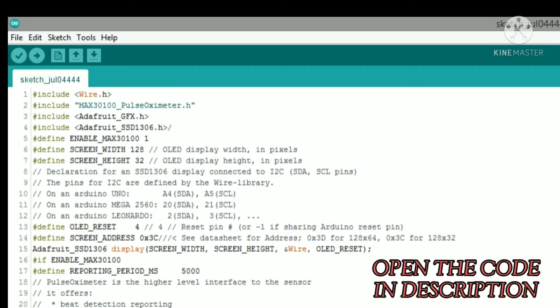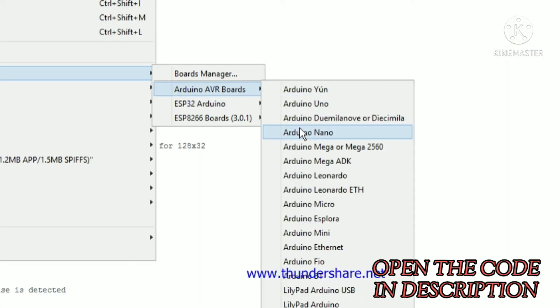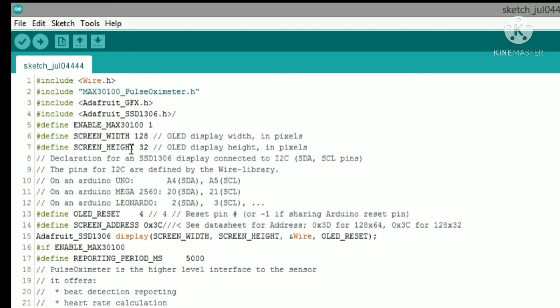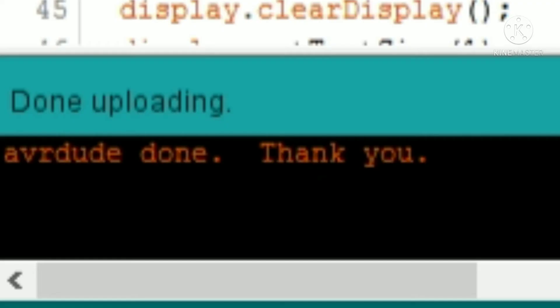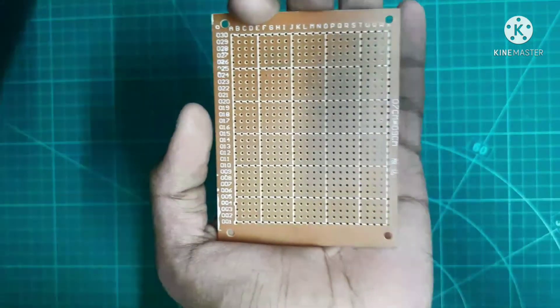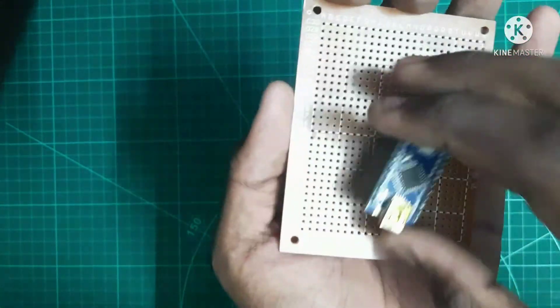Connect your Arduino to your system and select your board — we are using Arduino Nano in this project. Select the processor and port as well. We need to select SSD1306 and make the necessary changes, then click the upload button. You can see the code has been uploaded.